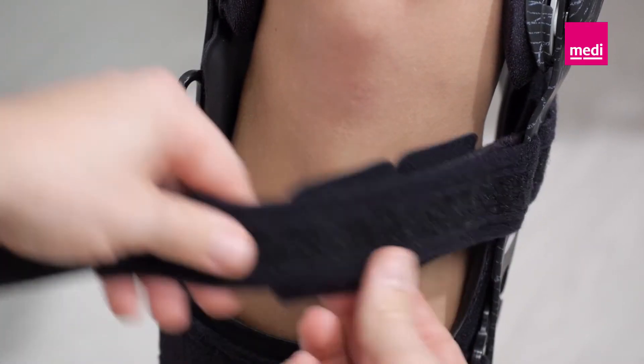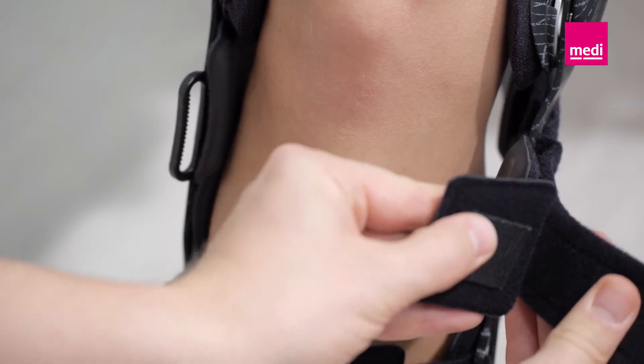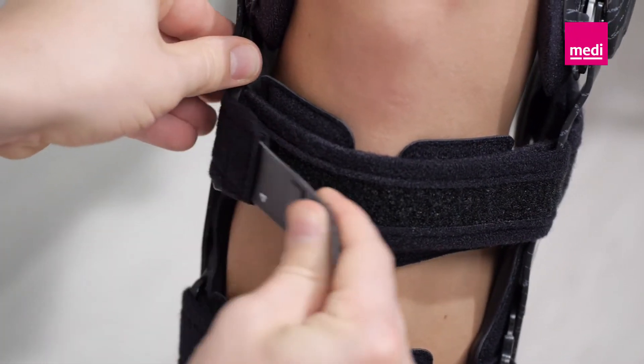Please note that the pads on strap number four are split. These can be positioned around the scar if needed, in order to avoid unnecessary pressure on a possible surgical scar.